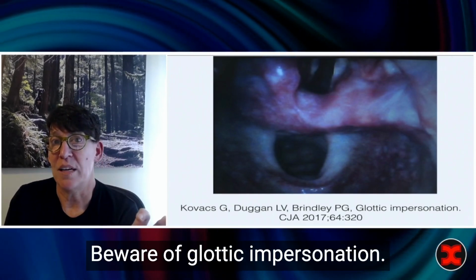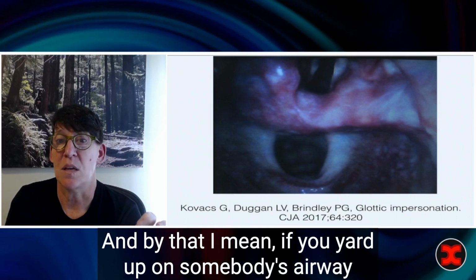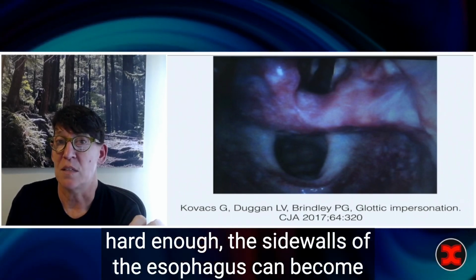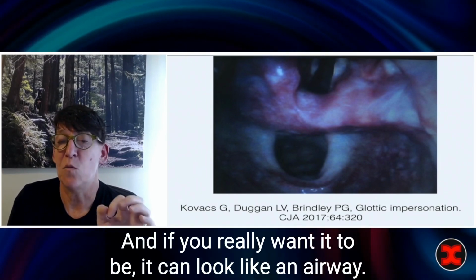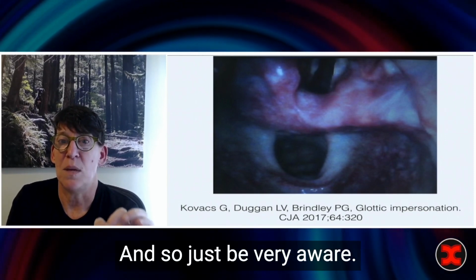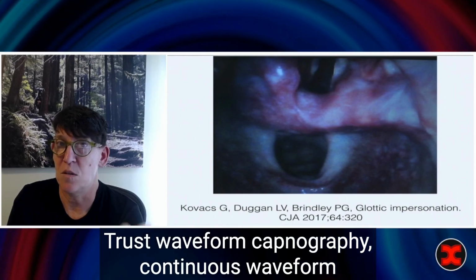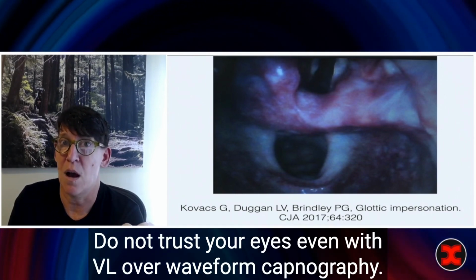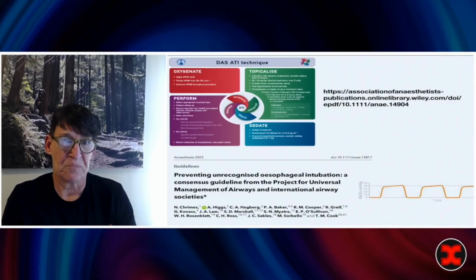Beware of glottic impersonation. And by that I mean if you yank up on somebody's airway hard enough, the sidewalls of the esophagus can become quite white and get quite pale. And if you really want it to be, it can look like an airway. And so just be very aware. Trust waveform capnography, continuous waveform capnography over your eyes. Do not trust your eyes, even with VL, over waveform capnography.